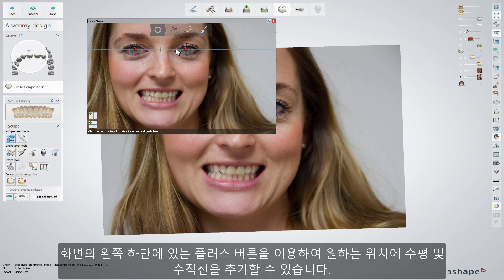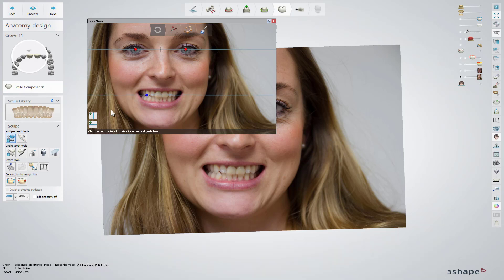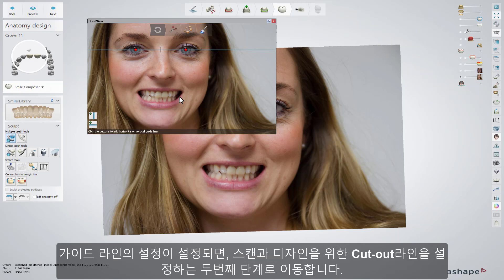You can add more horizontal and vertical guidelines by clicking on the plus button and then on the picture in the desired location. Right-clicking on a point or line enables you to delete that line or all lines.